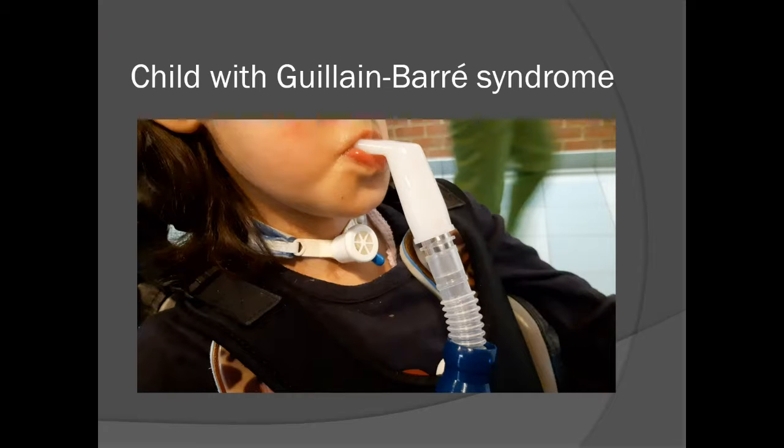This is to show you a special case we had some months ago. This is a young child. She must be almost 6 years of age, and she received a tracheostomy at the age of 2, and she progressively recovered from Guillain-Barré syndrome. She is totally paralyzed in her arms, but she has good strength in her legs, and we tried the mouthpiece just with the hope to decannulate, and I think that now she is already decannulated. I will show you this very short video.